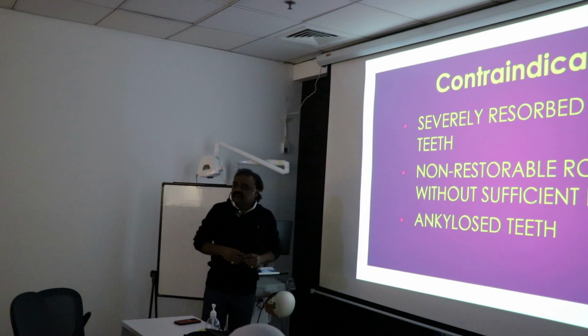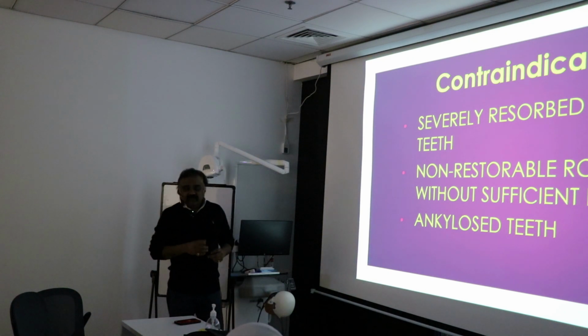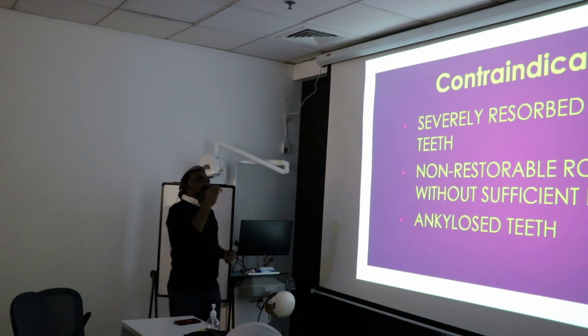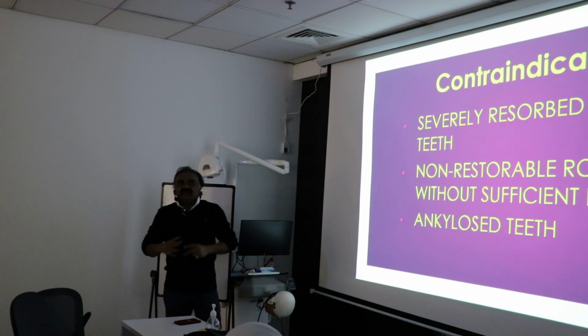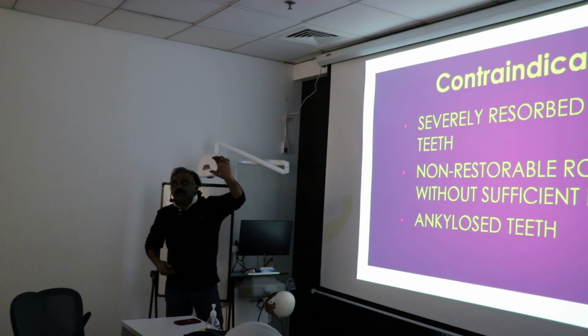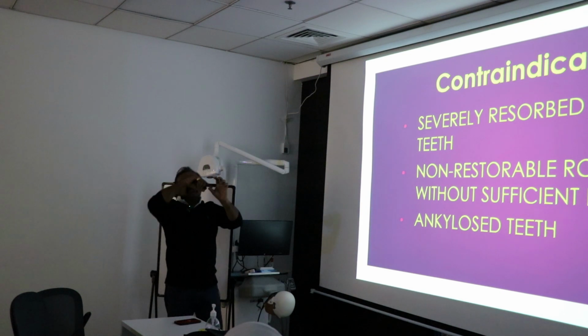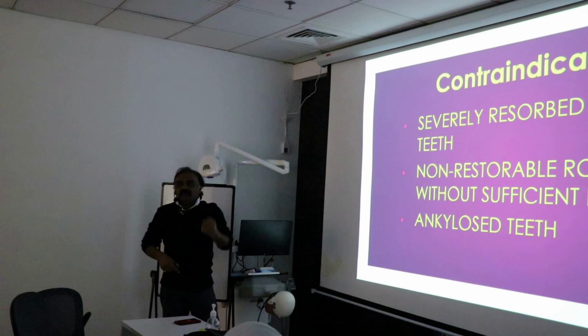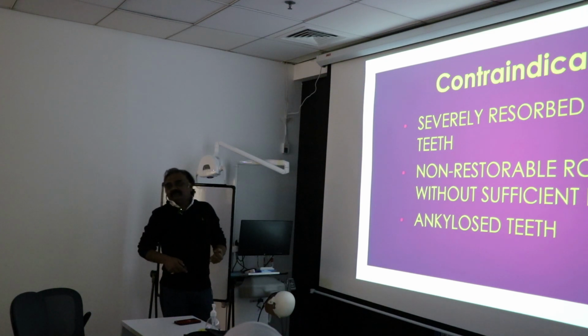Of course, you cannot go to a situation and do an orthodontic treatment for a patient where if you tap, the tooth is going to come out. Definitely not. But clinically, all you have is an intraoral periapical radiograph. I take a radiograph, I have a look at it, and if I find that the apical 1/3 of the root is attached to the alveolus, that amount of periodontal ligament is sufficient for me to start to bring about the extrusion.